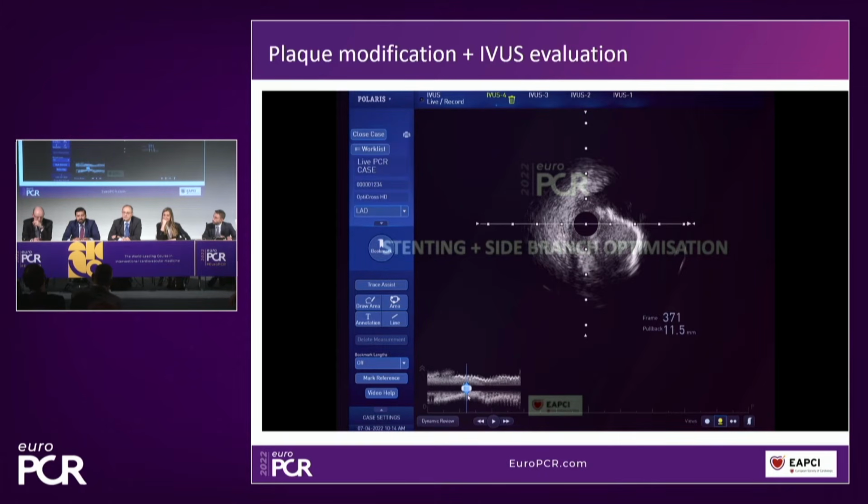If it's less than 1 millimeter thick, the cutting balloon will be effective. The second is, if you are going to use it, you want a balloon that is fairly compliant but has multiple blades. There are different products on the market, and the Wolverine tends to expand exceptionally well, although it has a limit of 12 atmospheres. I size it 1-to-1 and make sure that every part opens up appropriately.